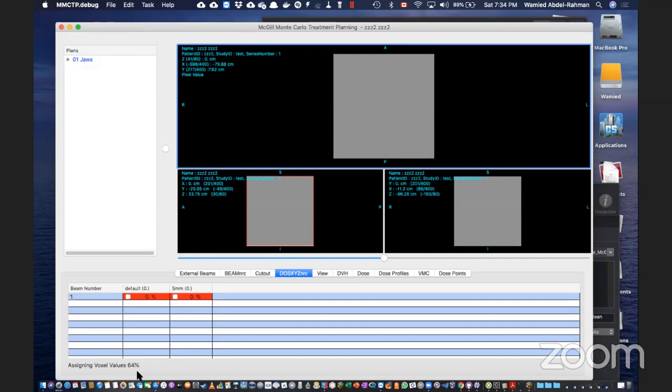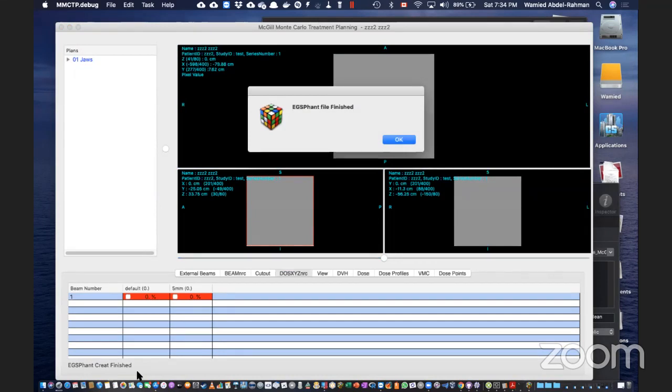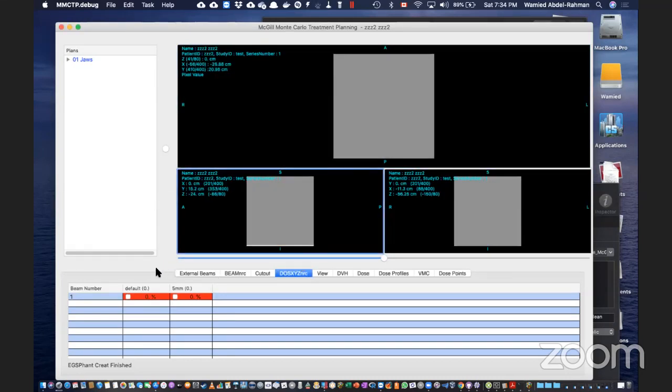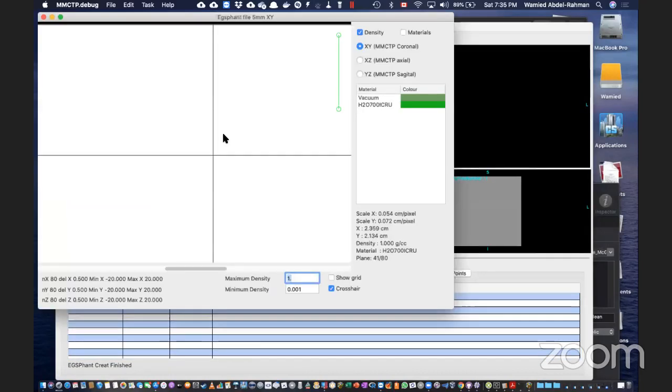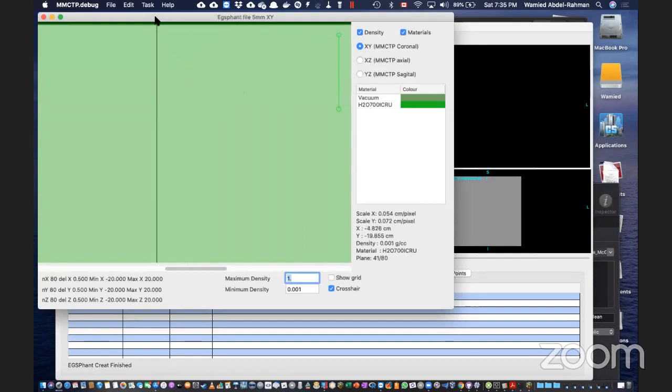Andrew, I have a question. Now my voxel size is larger than the pixel, so a voxel has multiple pixels. In a patient, how do you calculate an average CT for that voxel? Well, it's not looking at an average. It's looking at what the value is at the center of that voxel. So if that area has a big gradient, it may not accurately portray it, because it's just looking at the Hounsfield unit at the center of that large voxel. But that Hounsfield unit is an average of its neighbors.